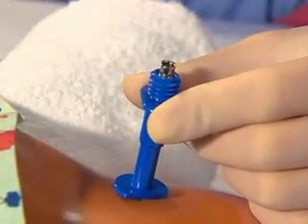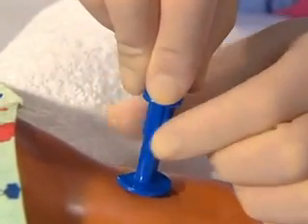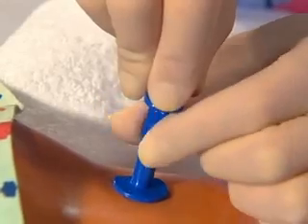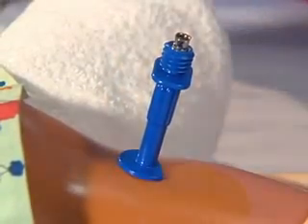If the device has a supporting flange, adjust it so the surface is flush with the skin to stabilize the needle and to avoid inadvertent deeper insertion. Take care to avoid disrupting the needle while adjusting the flange.